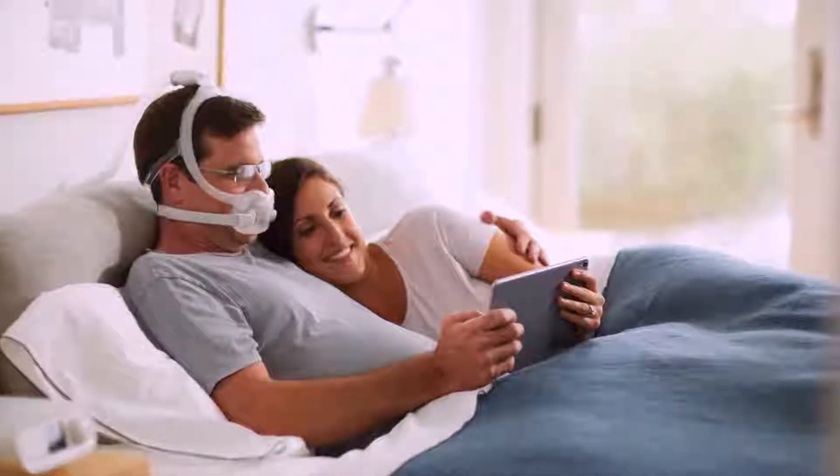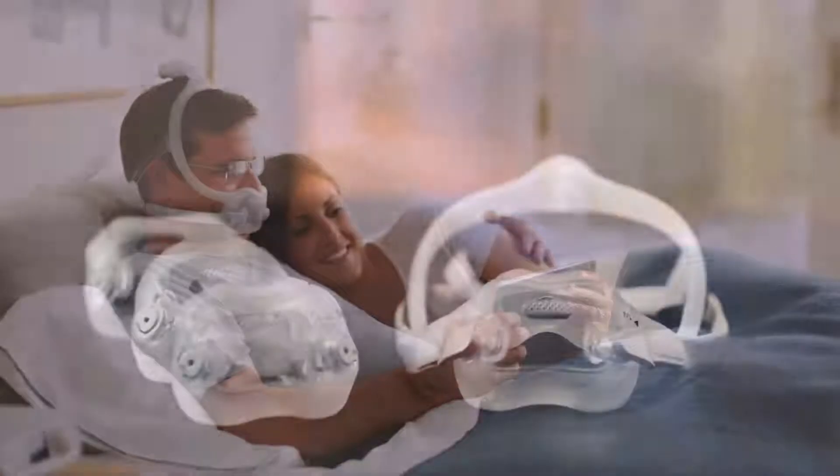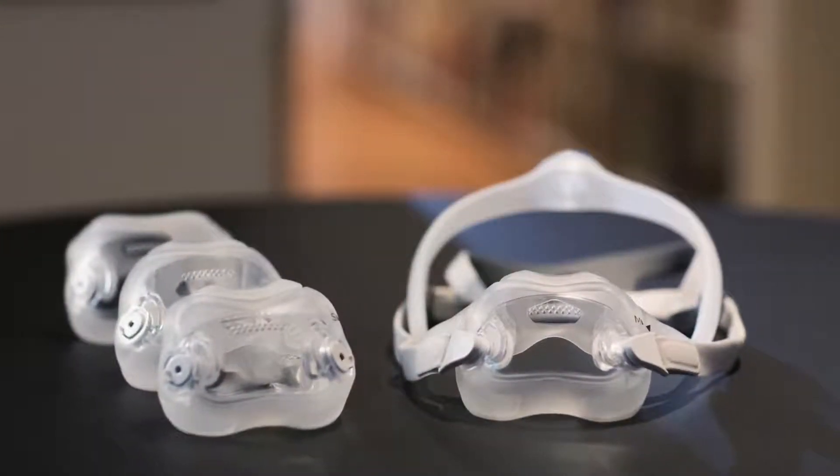The Philips Dreamwear Full Face Mask is an under-the-nose mask which provides an open field of vision. The mask is available in four cushion sizes and three frame sizes. You should always try the medium frame first with your selected cushion size before deciding if a different frame size is needed.